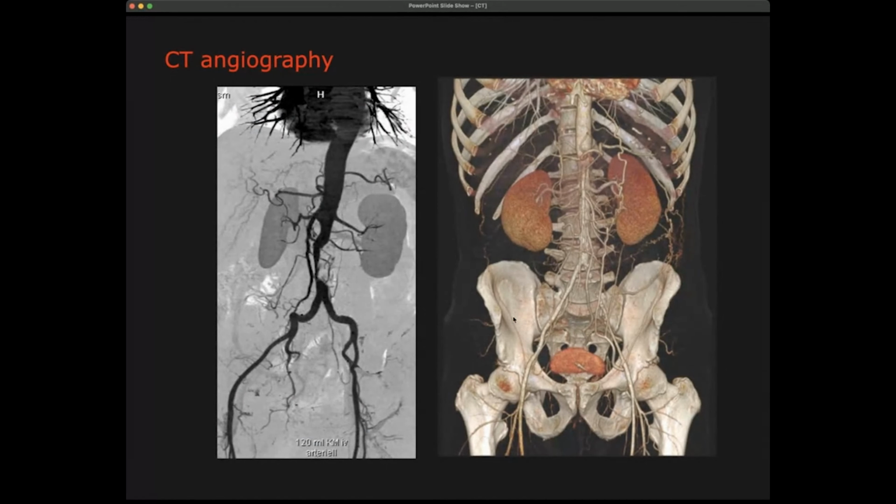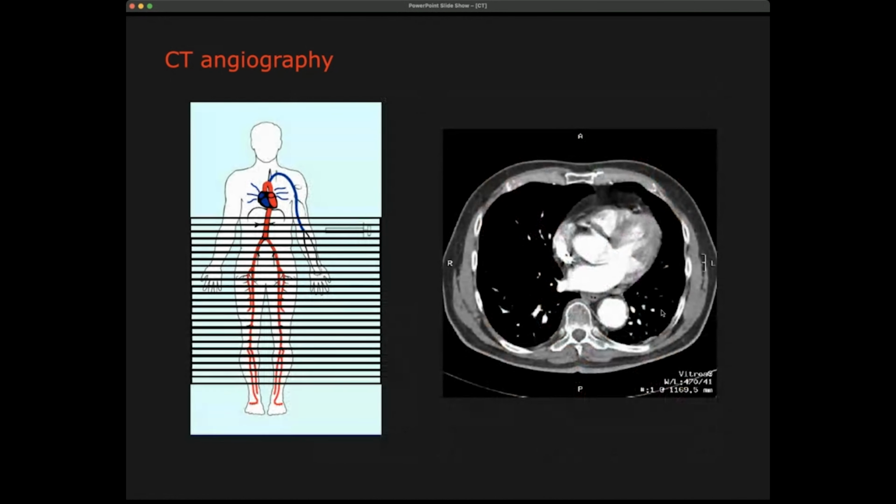But what you want to do is, of course, get an idea of these vessels. And so what we do here is this is what is being called a maximum intensity projection. So what you do is you take a scan, and then once you have all these kind of white dots here, you now actually make a new projection. And now you go through with a scan line. So you virtually calculate what is the highest value on this kind of path. And you do that for all the lines. So you call this a maximum intensity. You look at the maximum intensity and you only keep the maximum intensity with your projection.